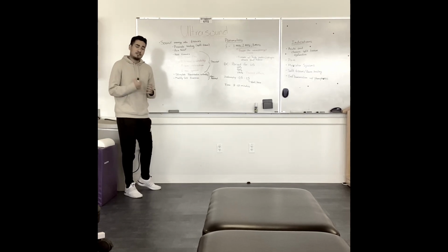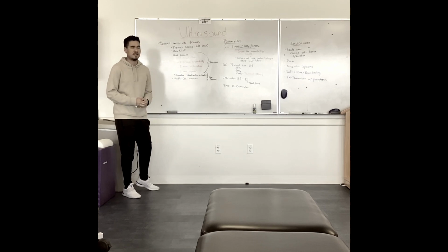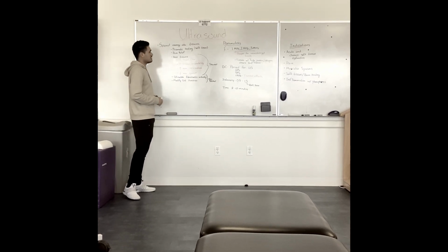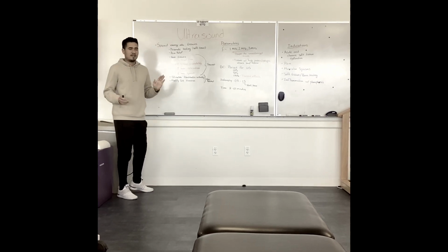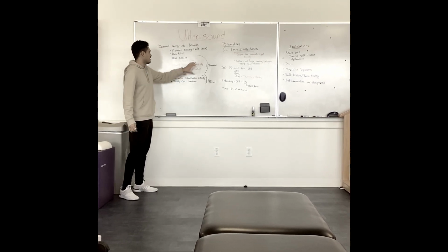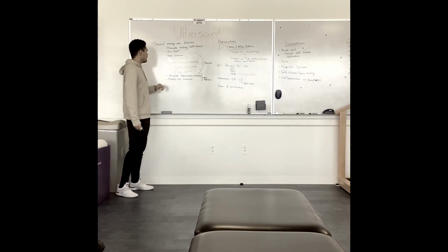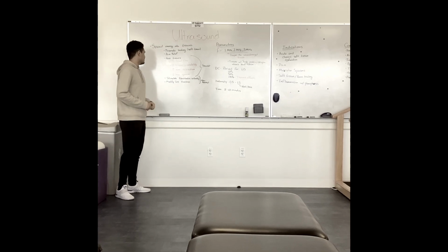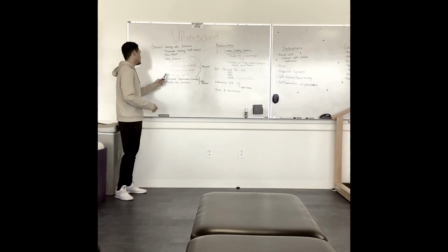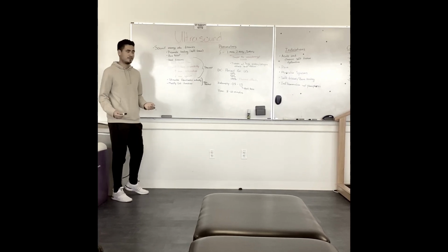So you just use a machine to send sound waves into tissues, and that's going to help promote healing such as soft tissue, pain relief, and then you have different aspects of ultrasound. So you have the thermal versus non-thermal. For thermal, it's going to increase blood flow, increase tissue extensibility, increase muscle relaxation, and it'll decrease muscle spasms. That's what you'll get if you use the thermal effects of ultrasound.